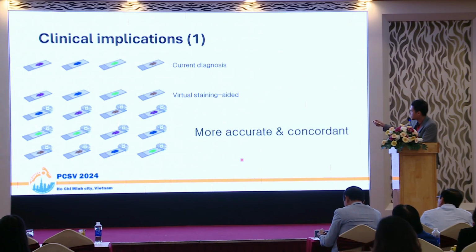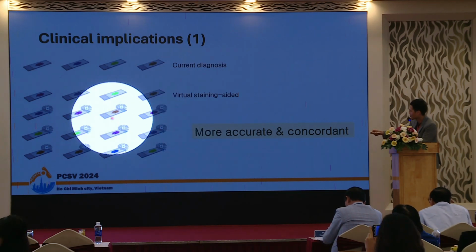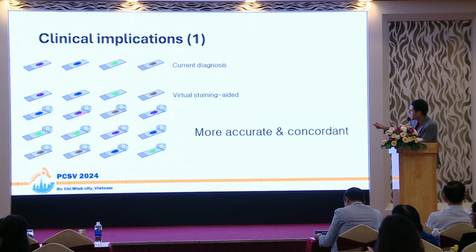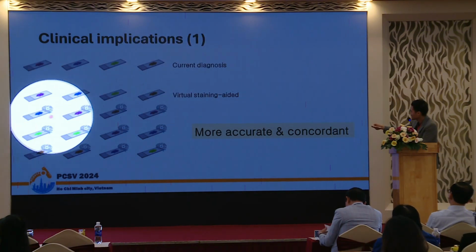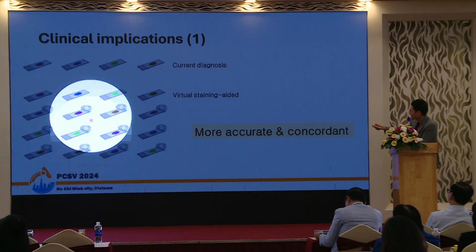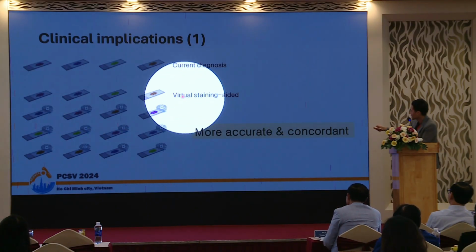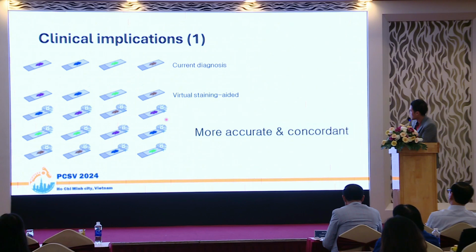So using these artificial stains or stain transfer or virtual stains, it provides more in-depth information for individual slides, so it can make a more accurate or concordant diagnosis.